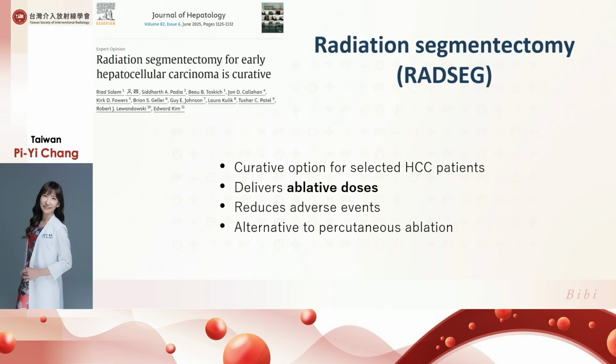So for curative intent, the first role of Yttrium 90 we call radiation segmentectomy. For this purpose, we use it as a curative option for selected HCC patients, and in this situation we deliver an ablative dose to reduce side effects. It is also an alternative to percutaneous ablation.